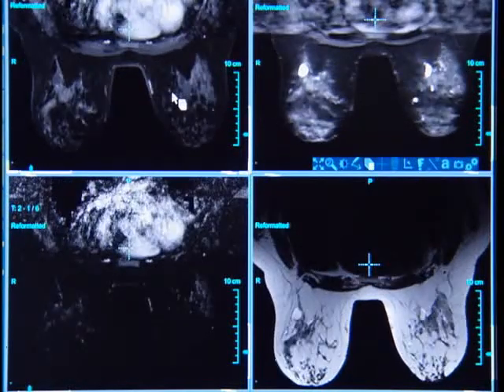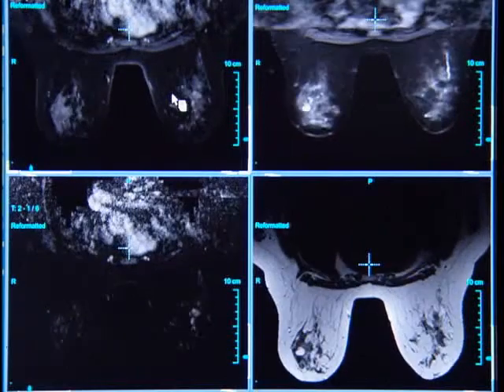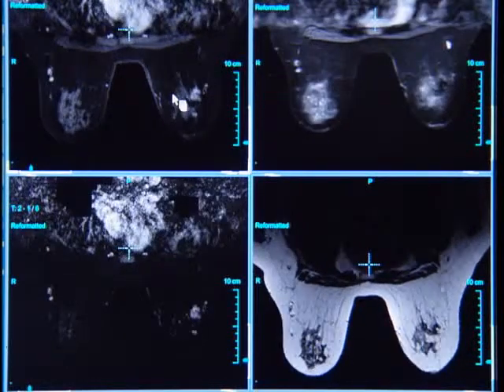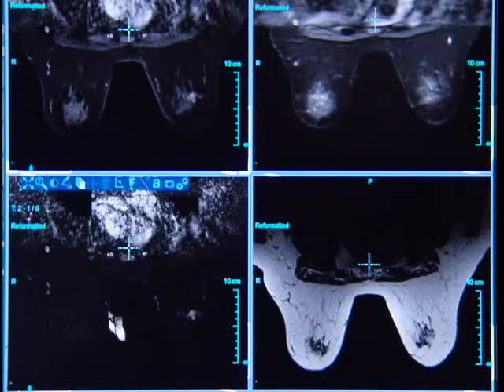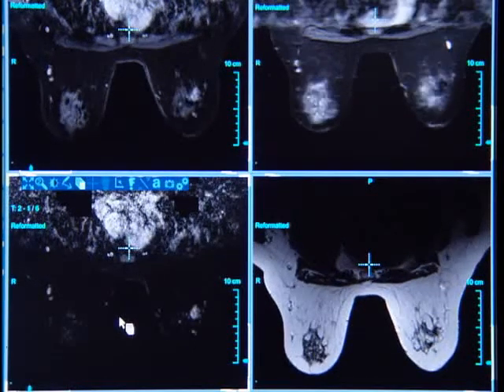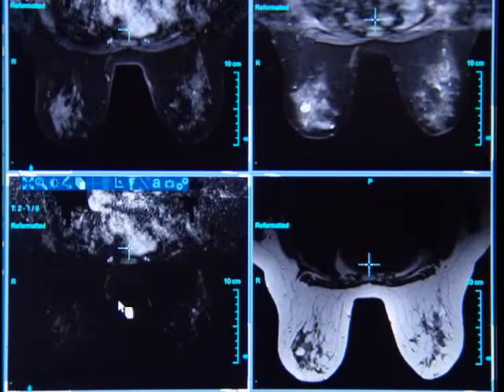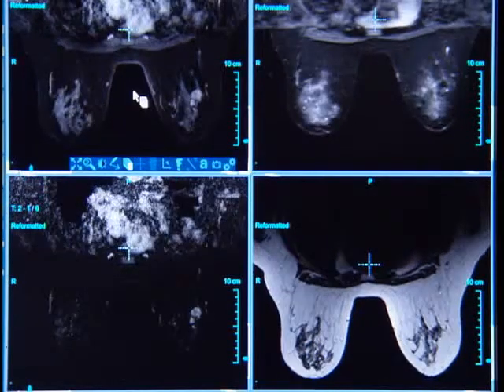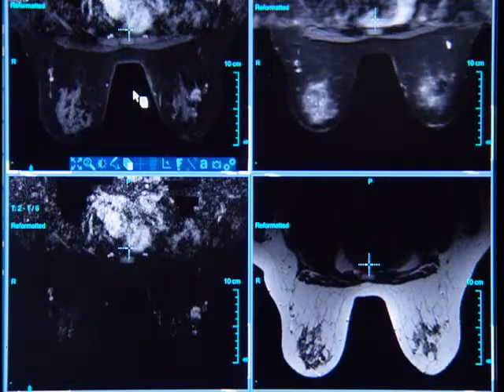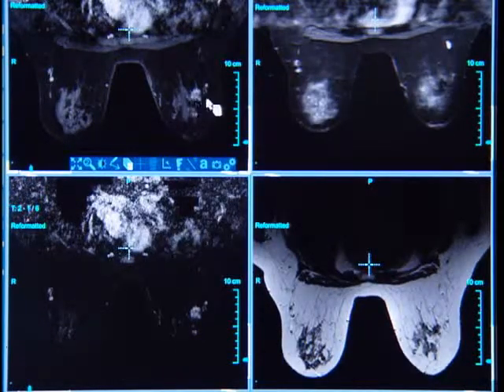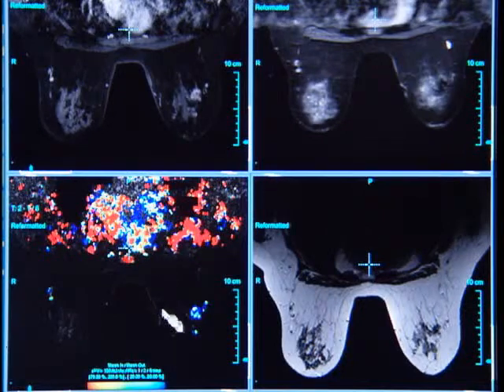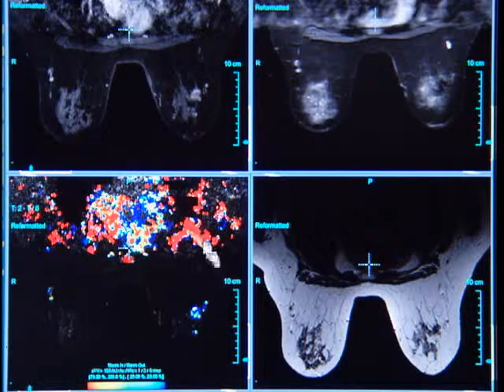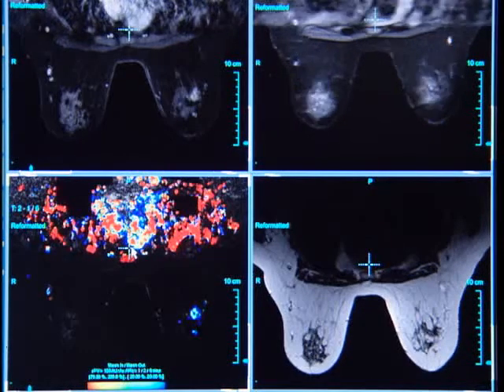Additionally, on the same pull-down menu, we have the actual post-gadolinium slice images correlated with the one-minute subtraction images. Here, you can evaluate the morphology of enhancement abnormalities and, if you choose to, also evaluate the enhancement kinetics involved within the lesion.